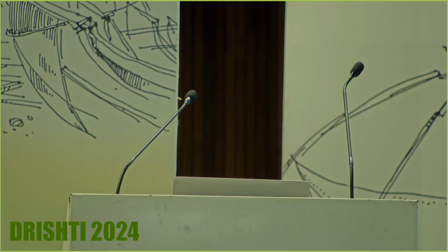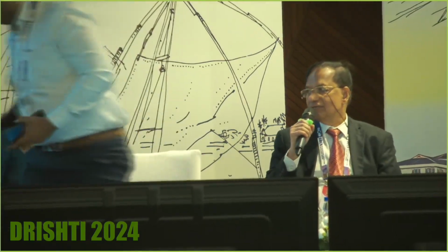I want to appreciate Dr. Leena for the wonderful videos. And for the beginners, I would suggest that you insist on injecting Viscoat rather than a 2% methyl cellulose, because the material stays inside the anterior chamber in a safer way.